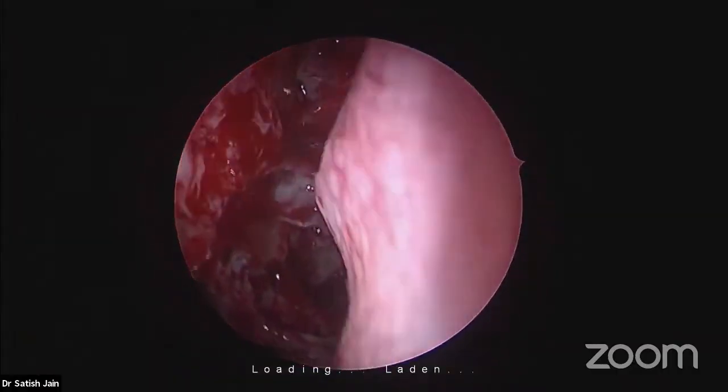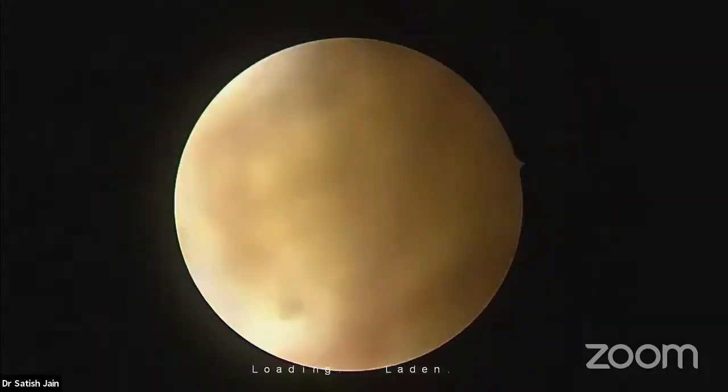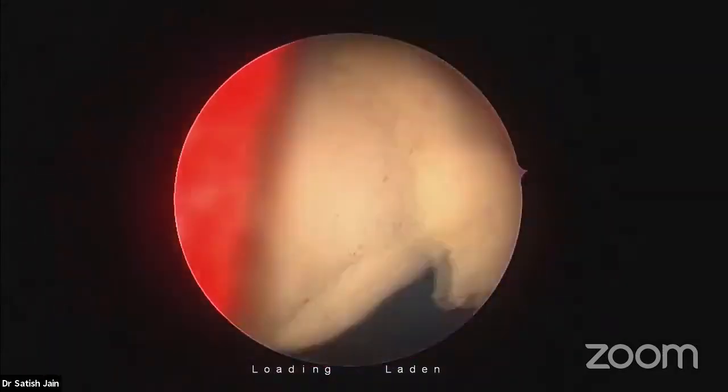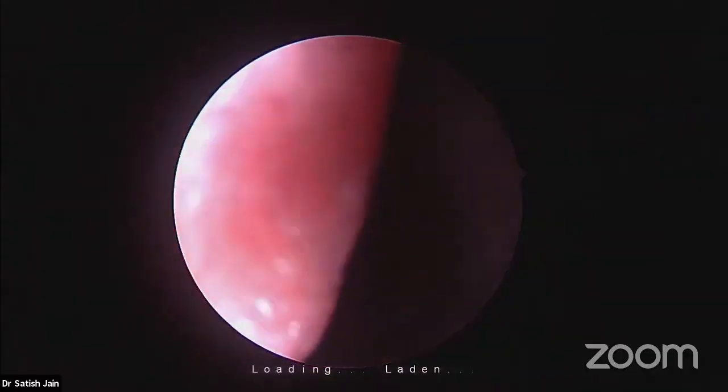Here on the right it is very, very shallow. I can tell you the location. That is supraorbital cell. And this is the middle turbinate. See how nicely it is lying close to the septum. The best treatment of the middle turbinate is not to disturb it.